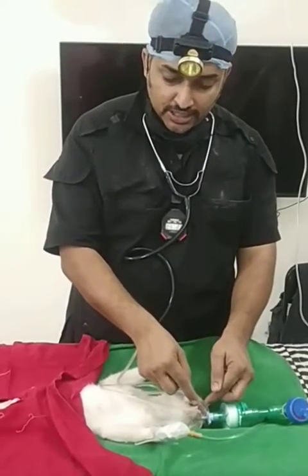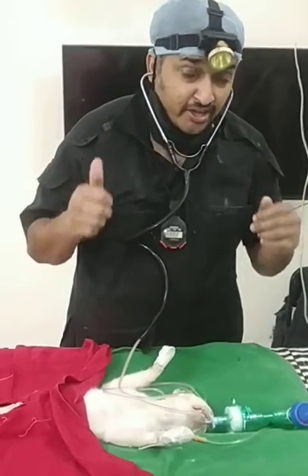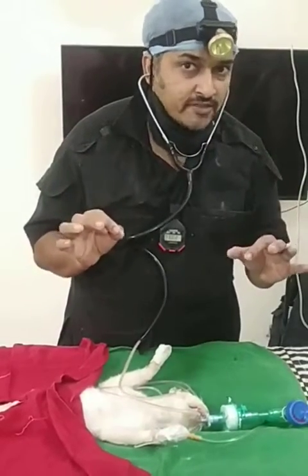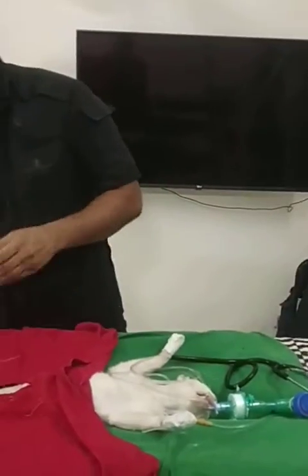I've measured it right from the canine to the heart space, and believe me, I'm hearing the same quality of sounds that I get with the cardiac stethoscope. We know how difficult it is to get a proper surgical stethoscope.